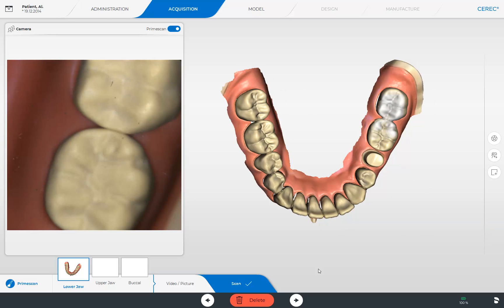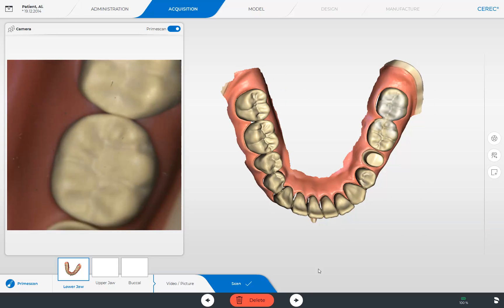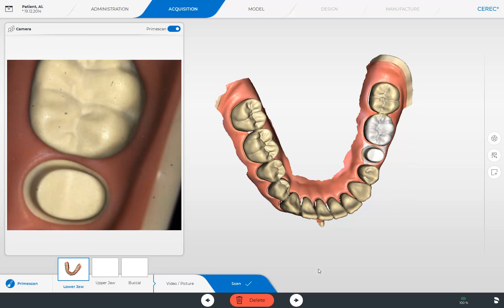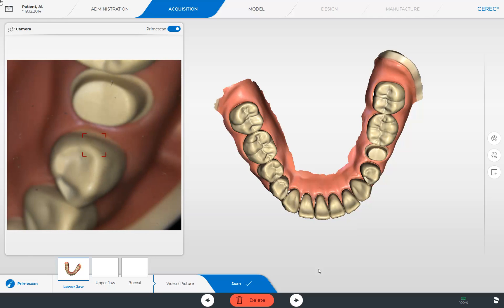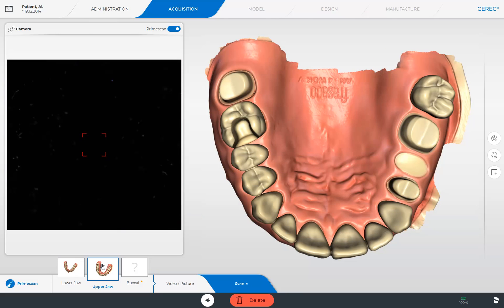Missing scan data can be re-scanned at the end. Afterwards, we switch to the upper jaw image catalog. Since the scan strategy is the same as with the lower jaw, we skip the scan procedure here, and next you see the already scanned upper jaw image catalog. As demonstrated with the lower jaw, we have scanned the upper jaw, including the surrounding gingiva, with just three sweeps.